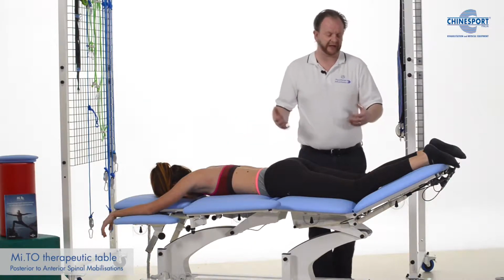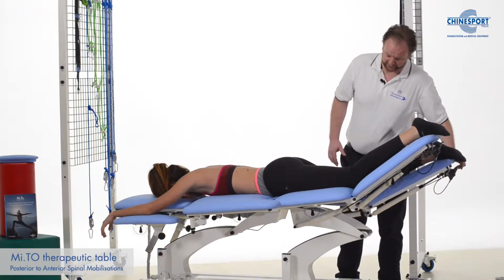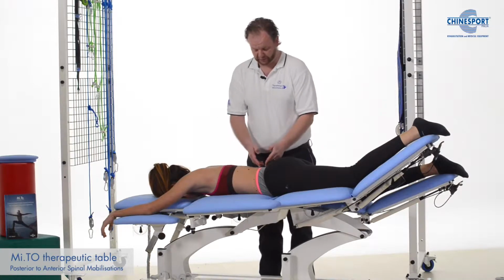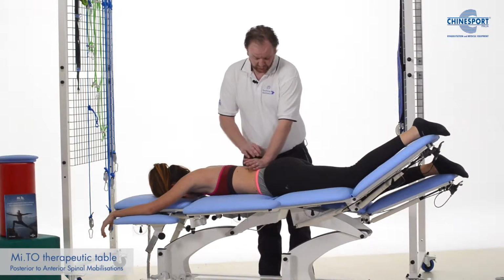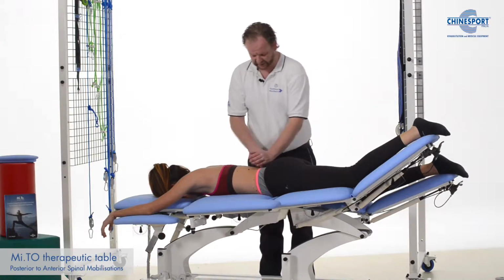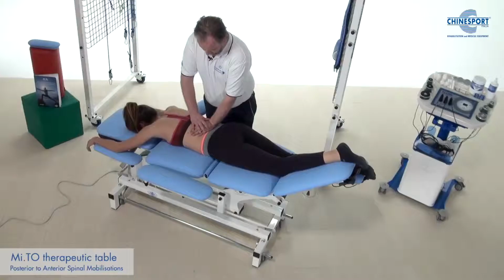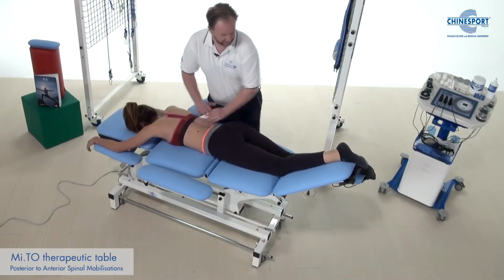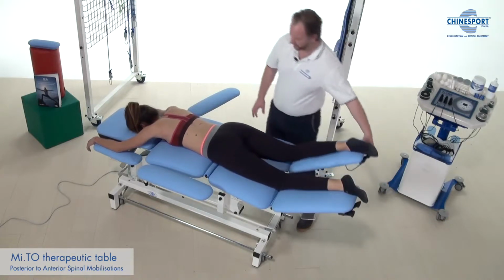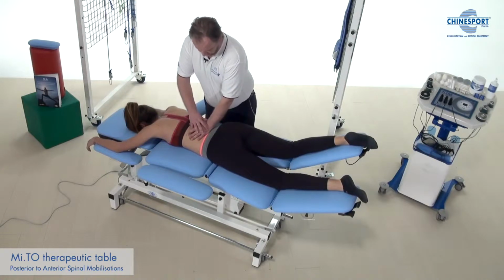Now, if we want to add a little bit of rotation in order to focus more or open one facet joint more than the other, or close one facet joint more than the other, then we can simply use the leg sections in order to create that motion in that position. And then we can use the same manual techniques again, and then we can do that to the opposite side, and we can start working again in the same way.